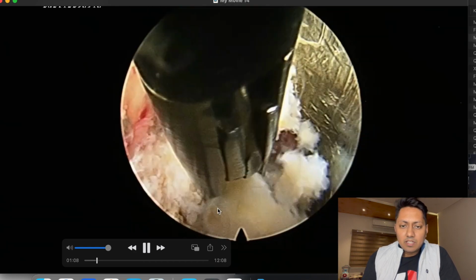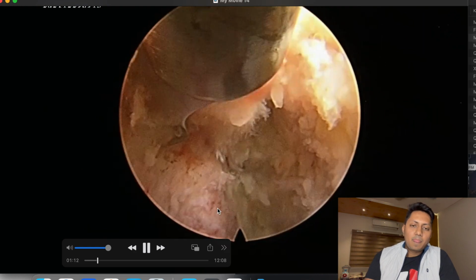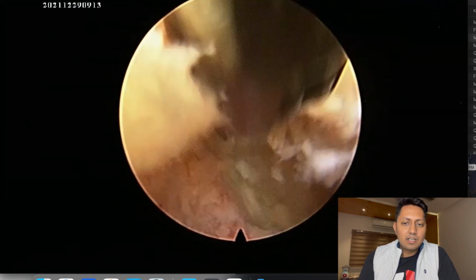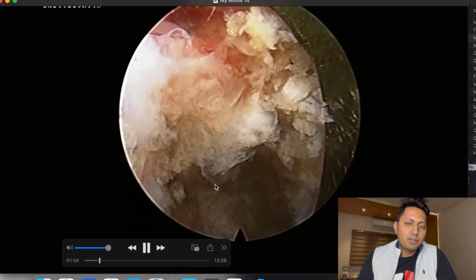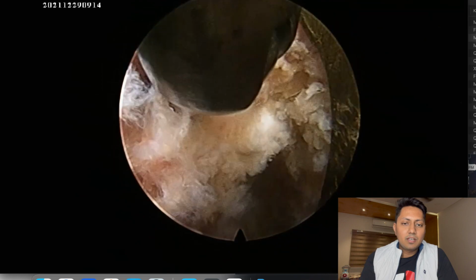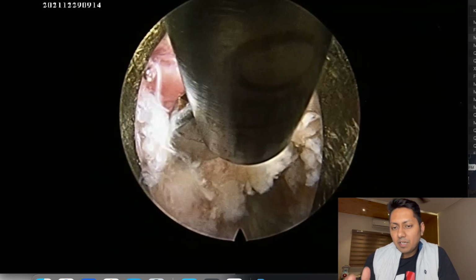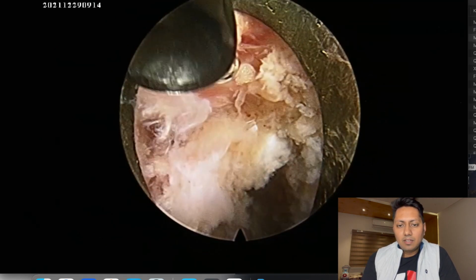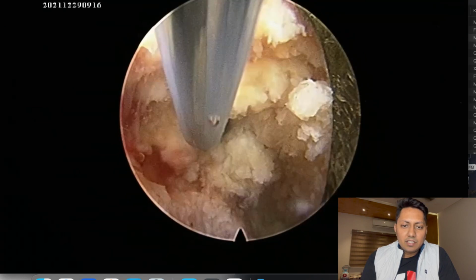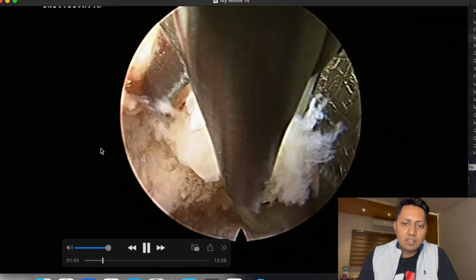In case of bulging disc, we have to remove the annulus by just cutting it. Now this instrument that you are seeing here is my new favorite instrument. It's a bendable curette. It's very sharp and I use it to detach the annulus from the end plate. It is very atraumatic to neural structures, so I am not worried of damaging any neural structures. After detaching the annulus, I just shrink it so as to visualize the disc structure.